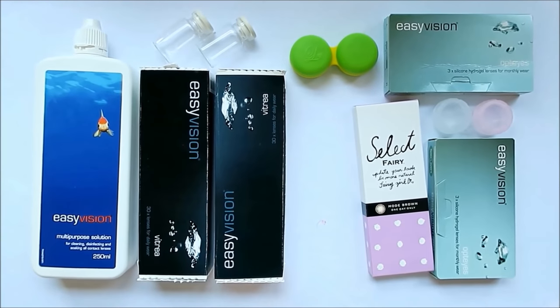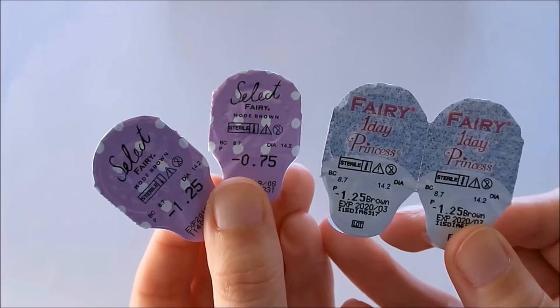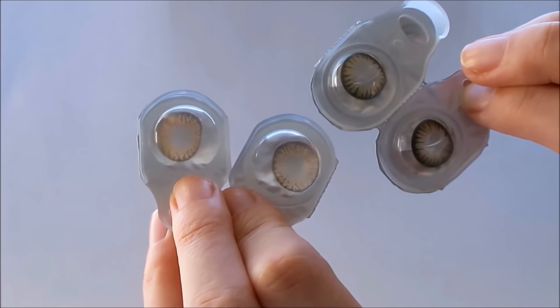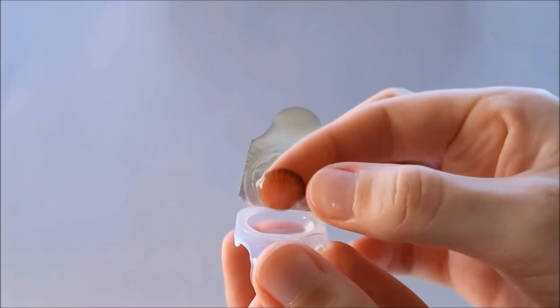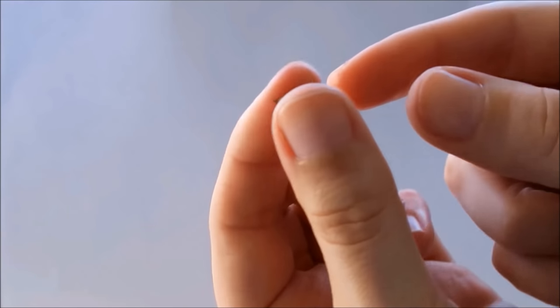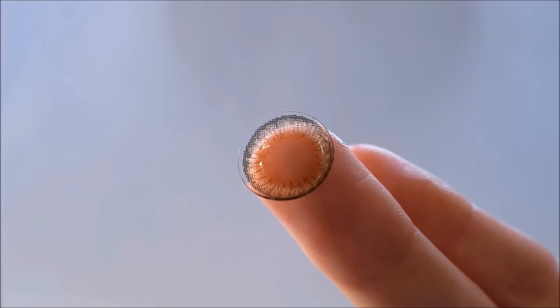Moving on to the more fun lenses — these are coloured daily contact lenses. I have 2 sets here and they are both from Sincere, the Select Fairy range: the One Day Princess and the Mode Brown lenses. Just like the clear dailies these come in a little rip tab, they don't need any prep or any solution, and they are fine to put straight into your eyes from the pack. These are a little bit thicker than a clear lens because they have colour in them, which makes them a little bit more uncomfortable for me to wear, but the dailies are better than monthly or yearly for coloured lenses. Plus if you only wear them once or twice a week, these are more inexpensive than a monthly or a yearly lens.